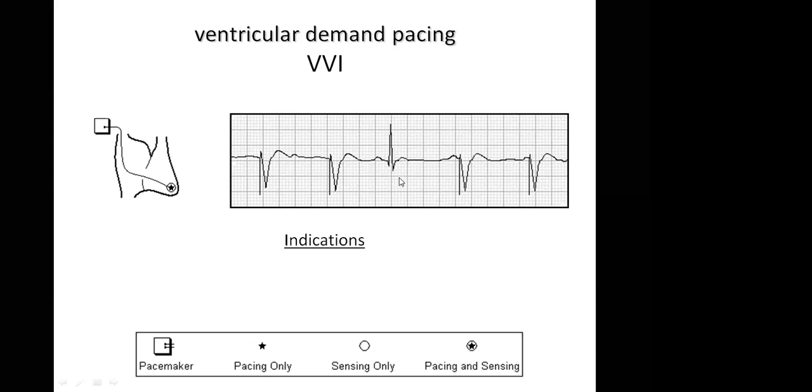So it means that it inhibited pacing at the time of this intrinsic activity. Exactly, that is it. That means it sensed this one and did not bother to pace. The response was inhibition. Yes, you get it, Dr. Adebowale? Yes.